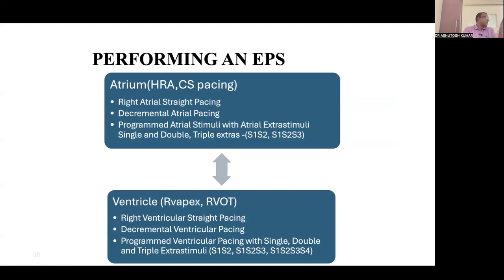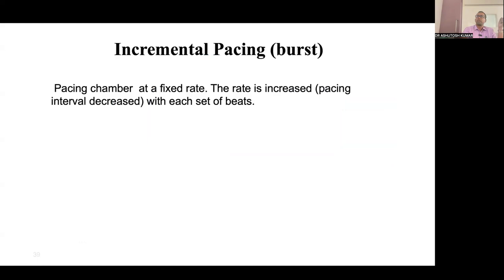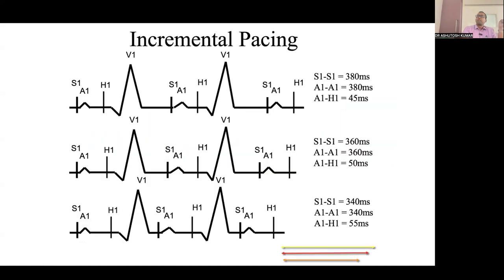In the atrium, we start from one location, either the right atrial appendage or the CS, and we start pacing. In the RV, we have two locations. We have to show from two locations the S1, S2, S3 protocol or V1, V2, V3 protocol with and without isoprenaline, and then establish whether the patient is inducing tachycardia or not. And these are the ways.